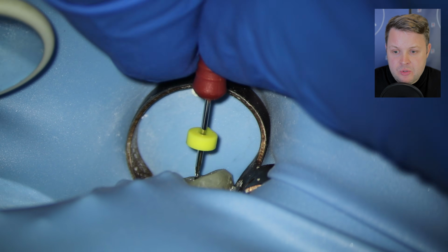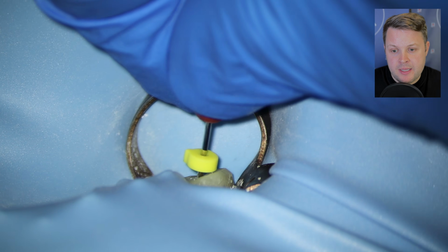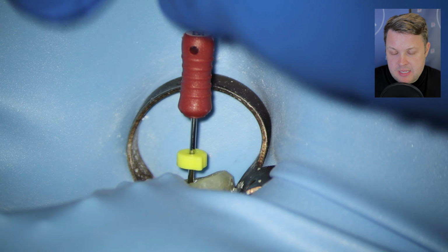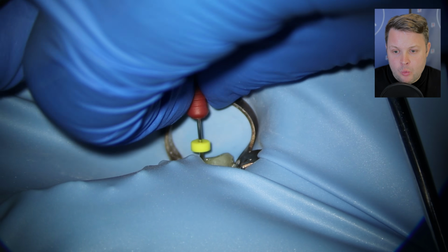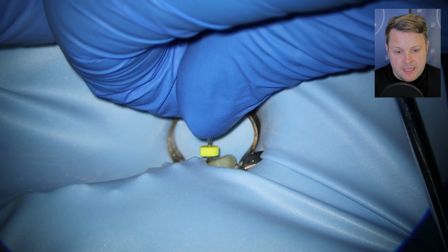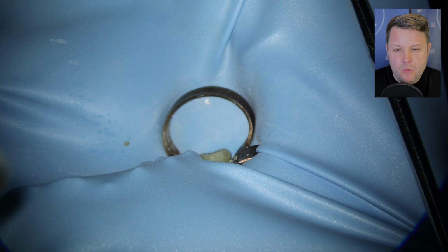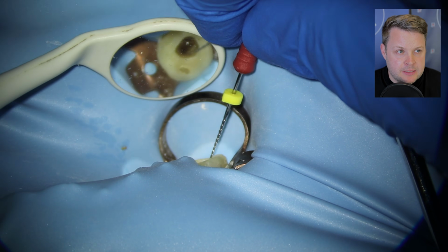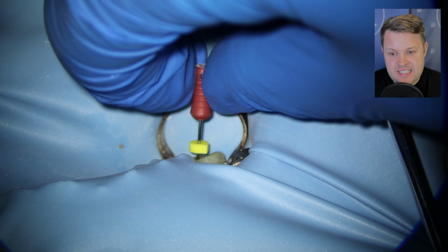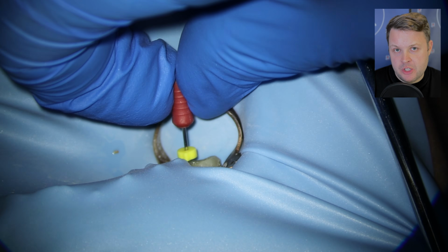So I'm going to use a size 25 Hedstrom to attempt to remove some of the GP at the apex. When you use these Hedstrom files and you know you're doing really well, you'll notice the Hedstrom file will screw into the GP and you can pull it out. What I noticed in this case was that there was no real resistance from this Hedstrom file when I was screwing in. So I feel like I was near the end of the tooth and there wasn't a lot of GP remaining.